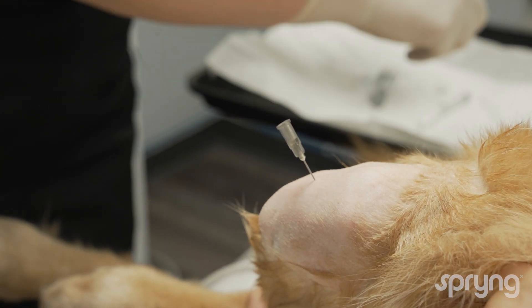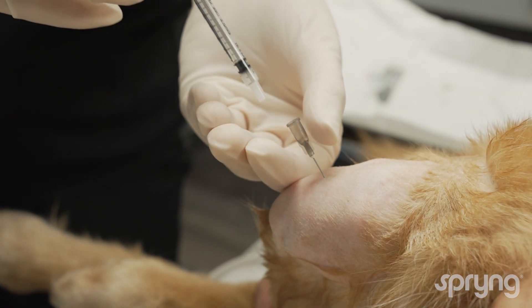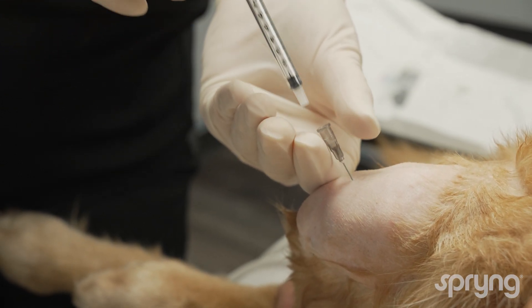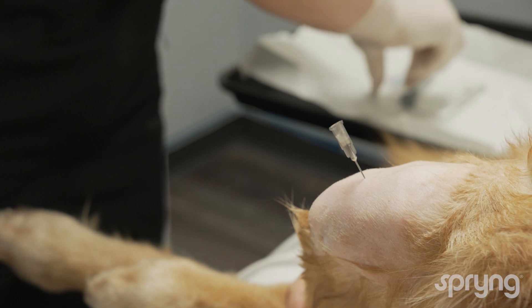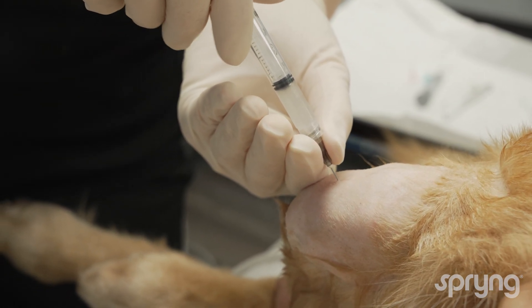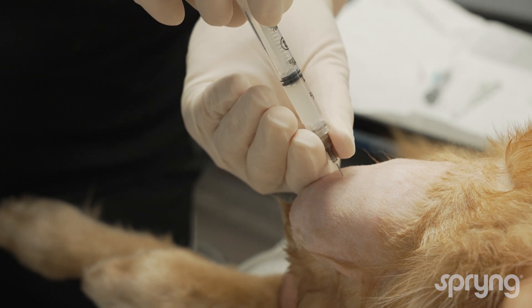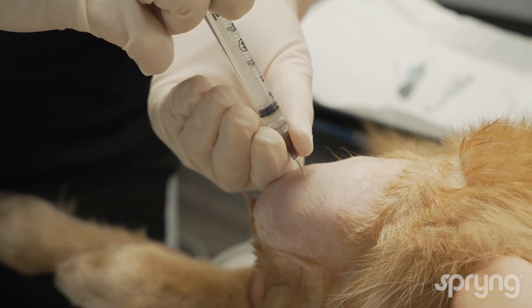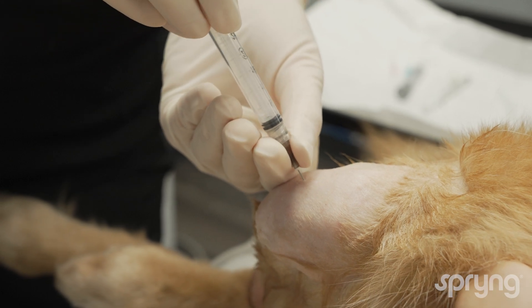Joint fluid should be acquired using a 5 ml syringe. If joint fluid is not acquired, redirect the needle. Inject the desired products — there should be no resistance. If resistance is met, redirect the needle and confirm appropriate placement by acquiring joint fluid.